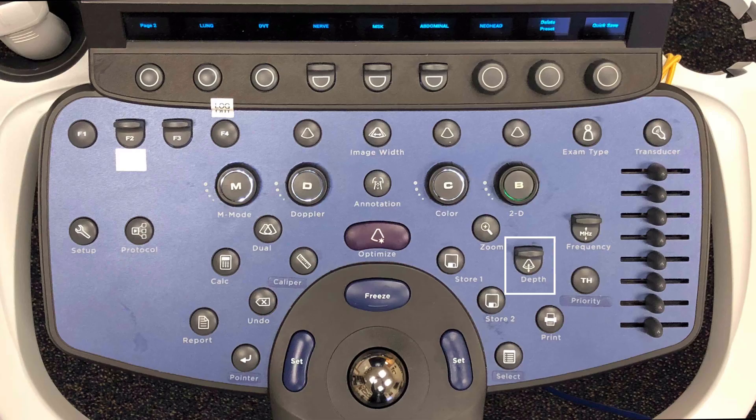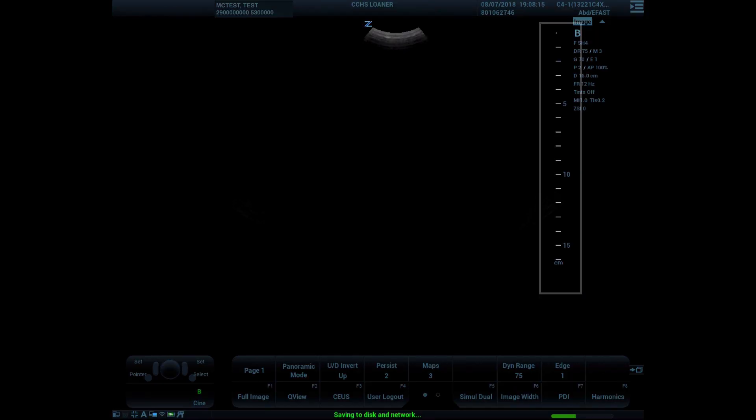Let's review how to adjust depth. The depth key is on the operational keyboard — toggle down to go deeper and toggle up to be more shallow. Depth markers are displayed on your screen with hash marks and interspaced numbers showing your depth in centimeters.